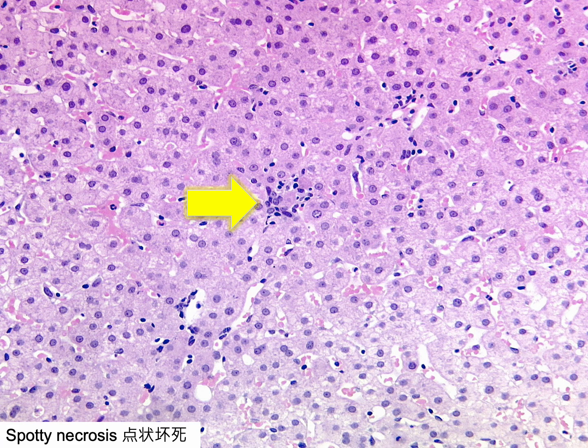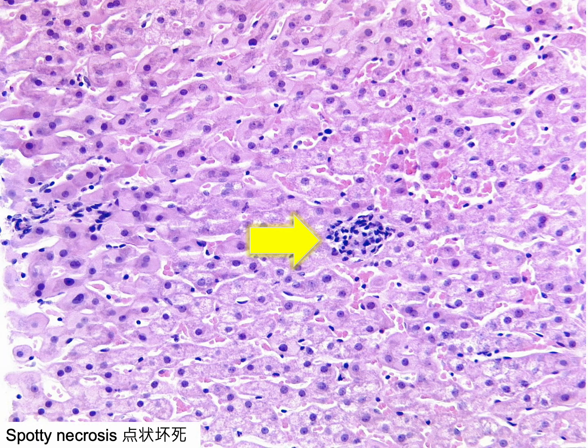A small cluster of lymphocytes and activated Kupffer cells/macrophages is observed in the lobule surrounding a dying hepatocyte. This is spotty necrosis, also referred to as focal necrosis, lytic necrosis, or oncotic necrosis, and involves the death of an individual or a small number of hepatocytes. The necrotic hepatocyte is often not identifiable, though the resulting parenchymal collapse, condensation of the reticulin framework, and associated mononuclear inflammatory cells can be recognised. Like apoptotic bodies, spotty necrosis is a nonspecific finding associated with a very broad range of liver diseases.